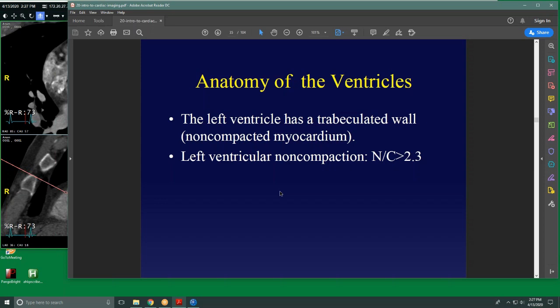And you can predict where that will be on the electrocardiogram. And what you do is you gate your acquisition, either with acquisition or reconstruction, such that you're only imaging or reconstructing at a certain phase of the cardiac cycle. By doing that, you can reduce cardiac motion in images.